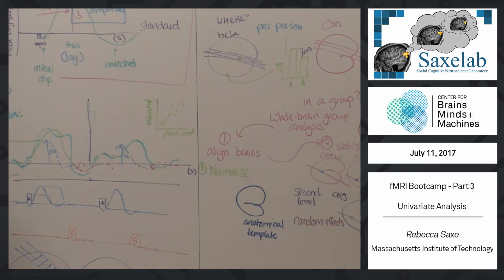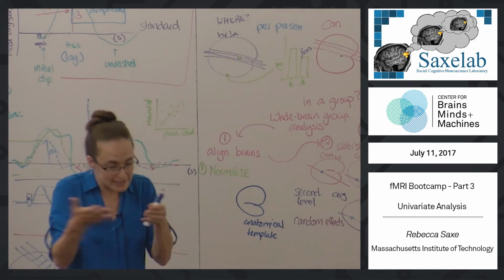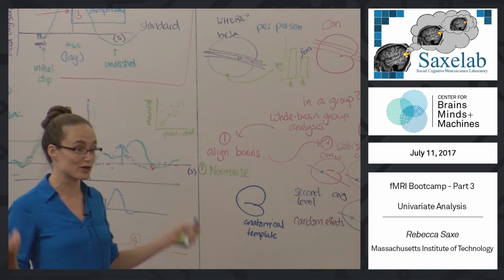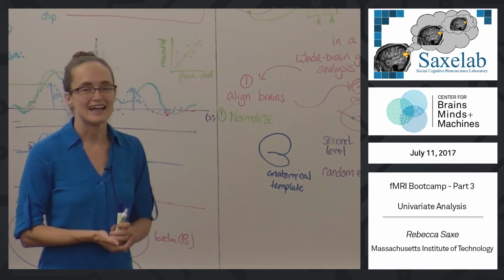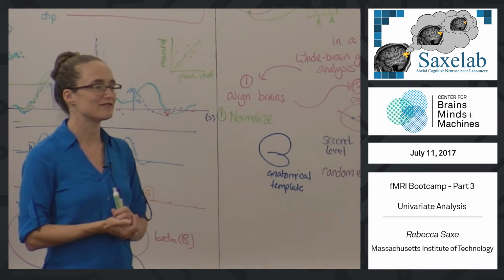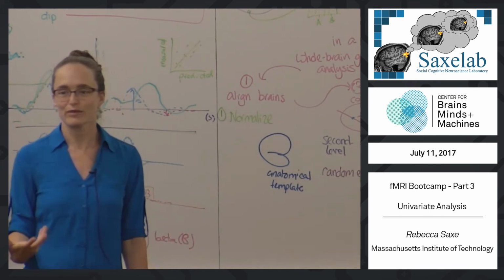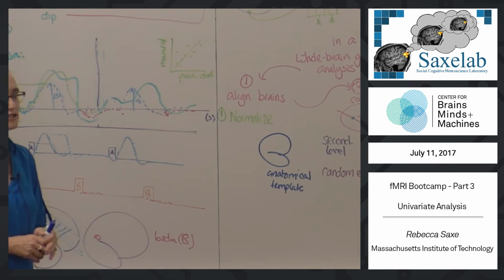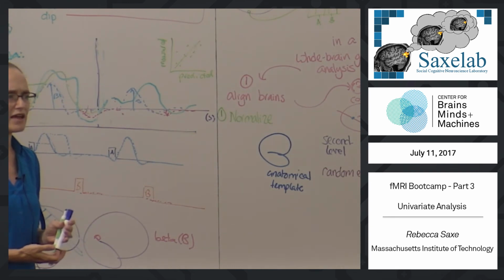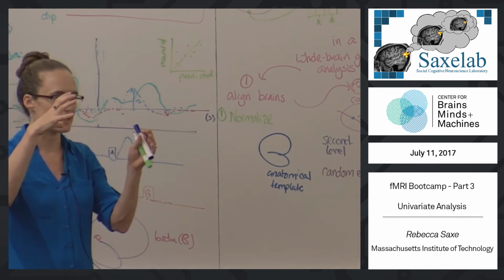OK, so that is one person's brain, the Talairach brain. Great, 1967. So one thing you might wonder: one person scanned in 1967, is that the best representation we could possibly have of the human? I do know that her temporal lobes had degenerated to some degree. Yeah, and so there was some sense that maybe she was not the perfect specimen for all of humanity. So at some point later, people decided not to use her brain as the representative brain for all of humanity. And so various different templates have been constructed. The generic brain in SPM, I think, is the MNI 152 brain, which is 152 people scanned at the Montreal Neurological Institute and carefully aligned and averaged by hand.